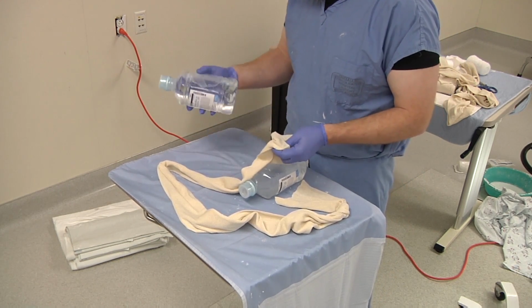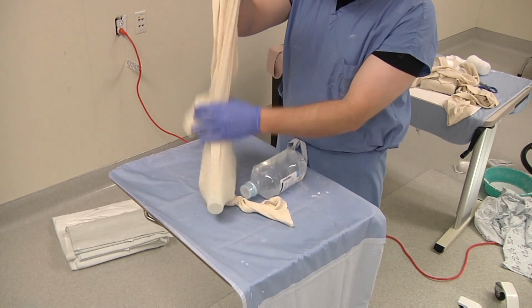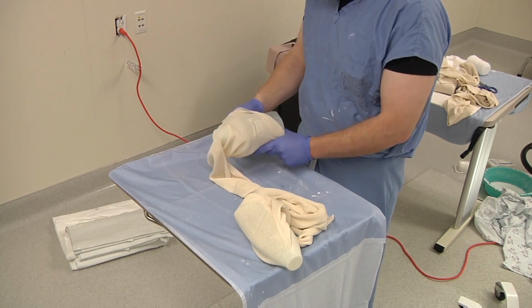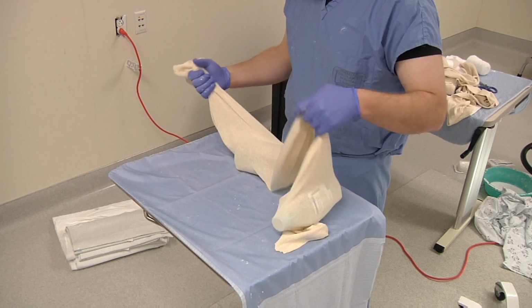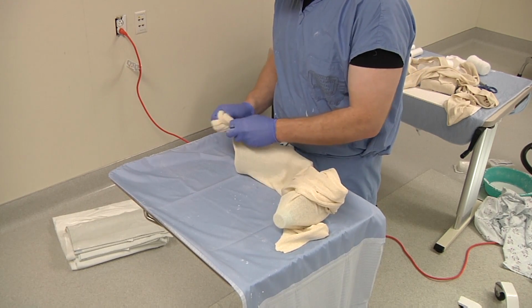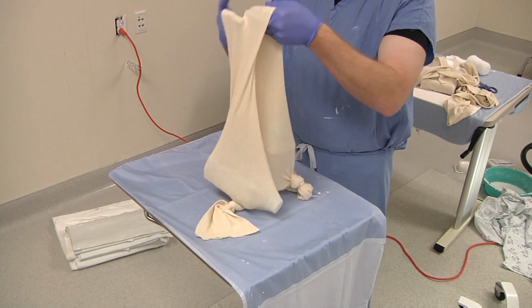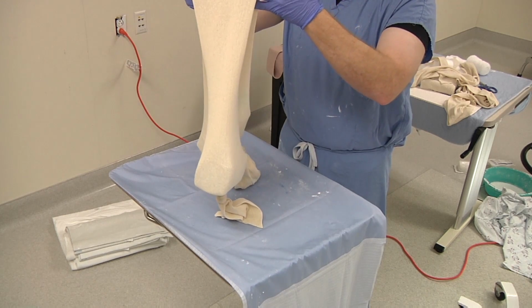So here I just have 2 1-liter bottles of water. You can use weights if you have those easily available. Simply stick both of them in and tie another knot at the end. There, you have a broad surface from which to apply traction with an acceptable amount of weight.